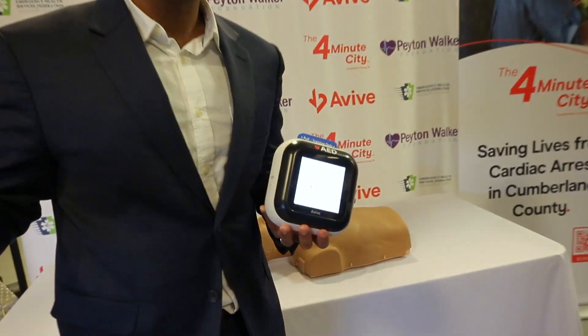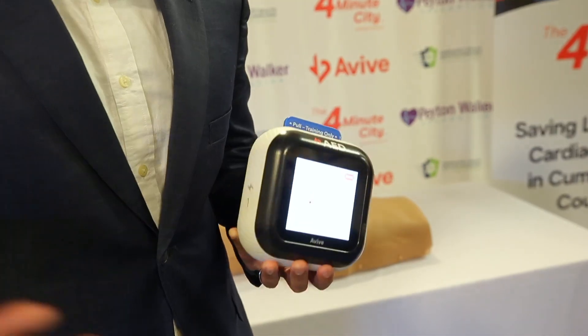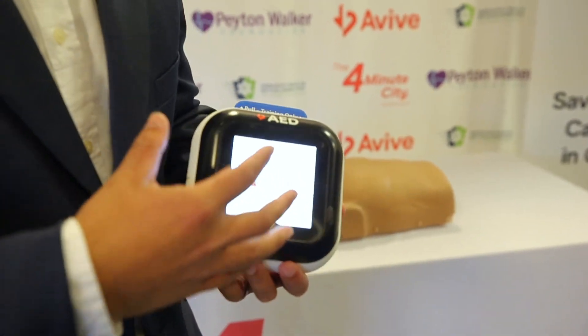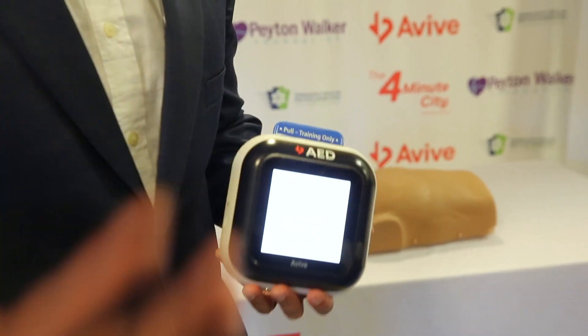911 can actually see the AED moving towards the patient. They can track how you're using the device and help you use it in real time. And that's what I'm going to show you now — once you arrive at the patient using this map, how you would use the device to save a person's life.